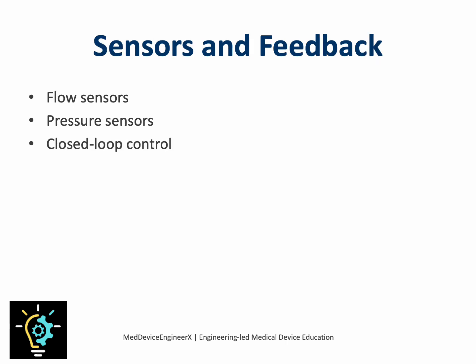Sensors are central to PB980 operation. Flow and pressure sensors provide continuous feedback to the control system, allowing real-time adjustment of gas delivery. If sensor data is inconsistent or missing, the ventilator cannot reliably control flow. In these cases, protective alarms are triggered to maintain patient safety.